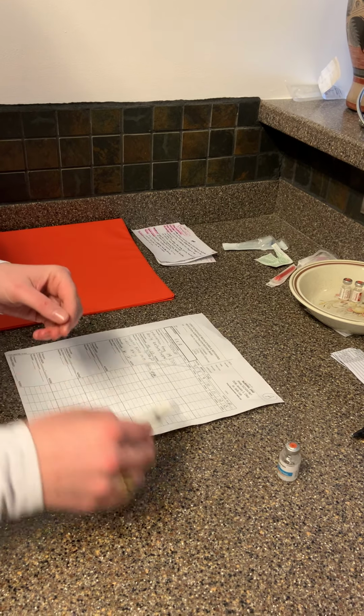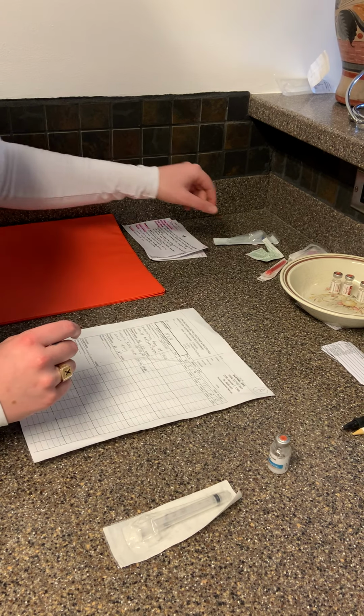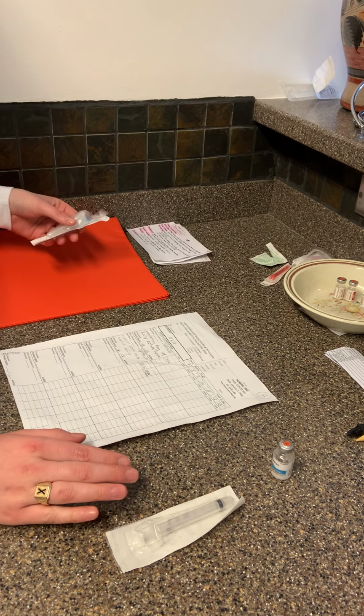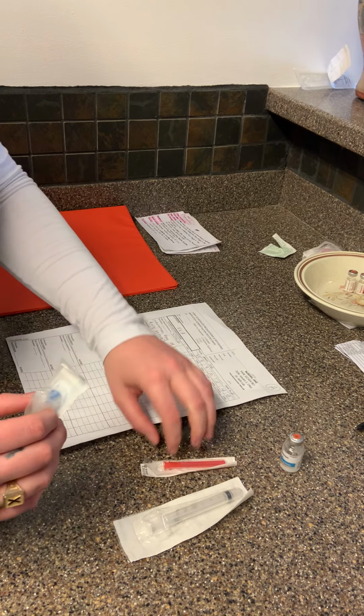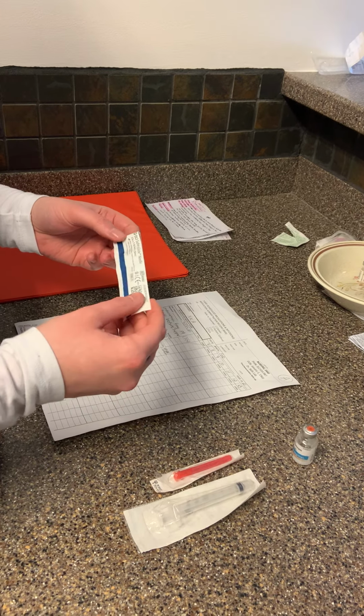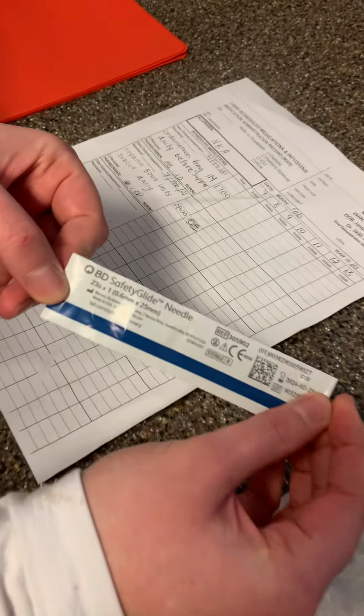So I have a 3 cc syringe. In clinical practice, I would be using a larger one, say a 5 cc, but for this demonstration, I'll just be using that. I have the blunt fill, and then the IM needle I'm going to be using is a 23 gauge 1-inch needle.